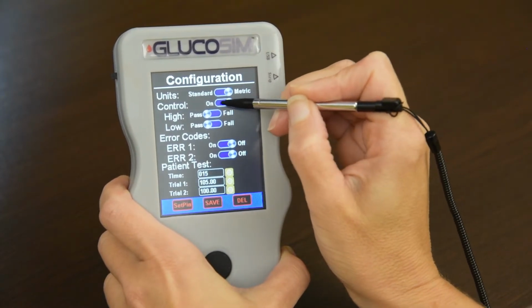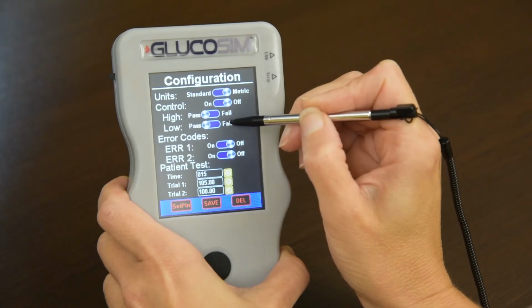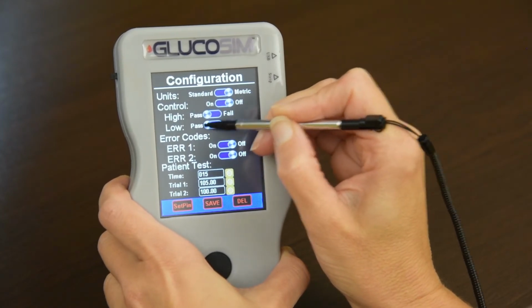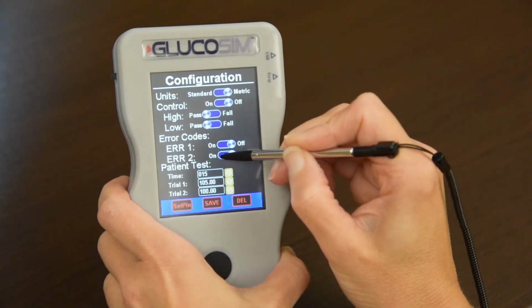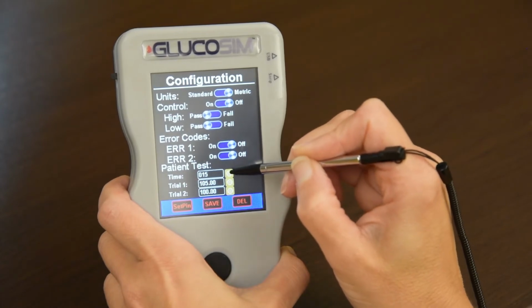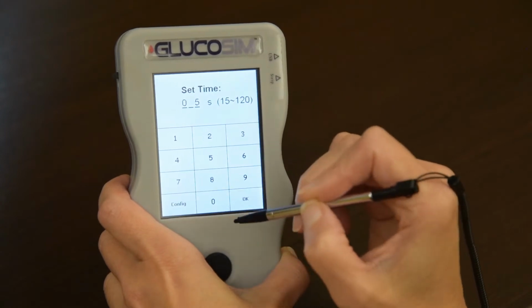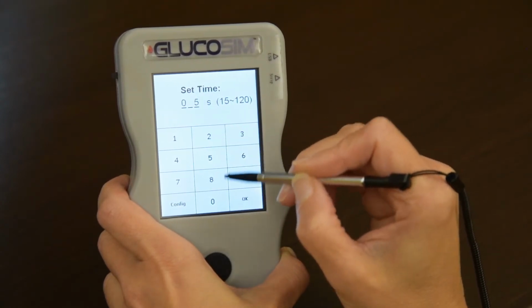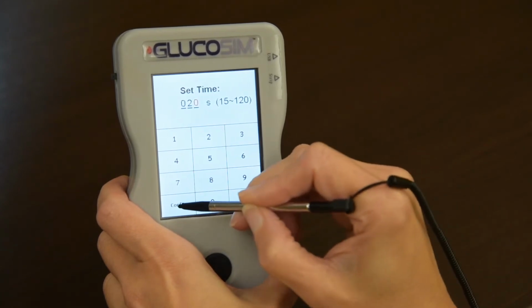The configuration screen allows the instructor to set up the simulated test. Set your chosen parameters for control, error codes, test time interval, and patient test. See instructions for further details on setting parameters. Once parameters are set, press the Save button.